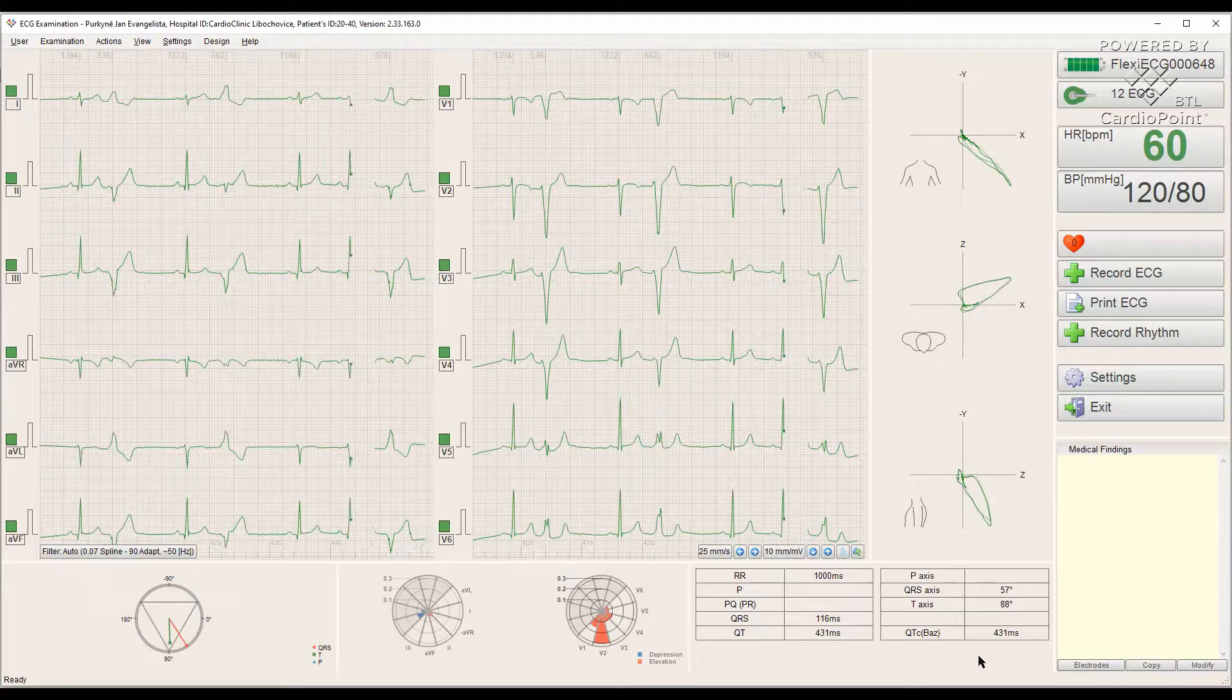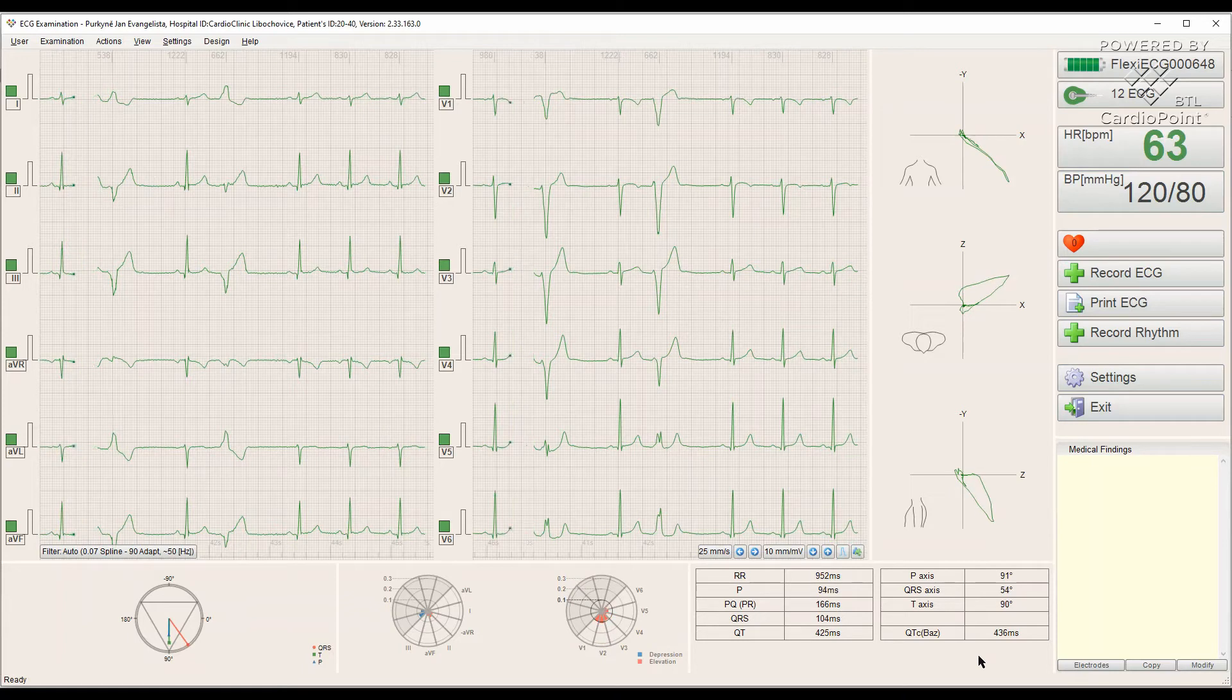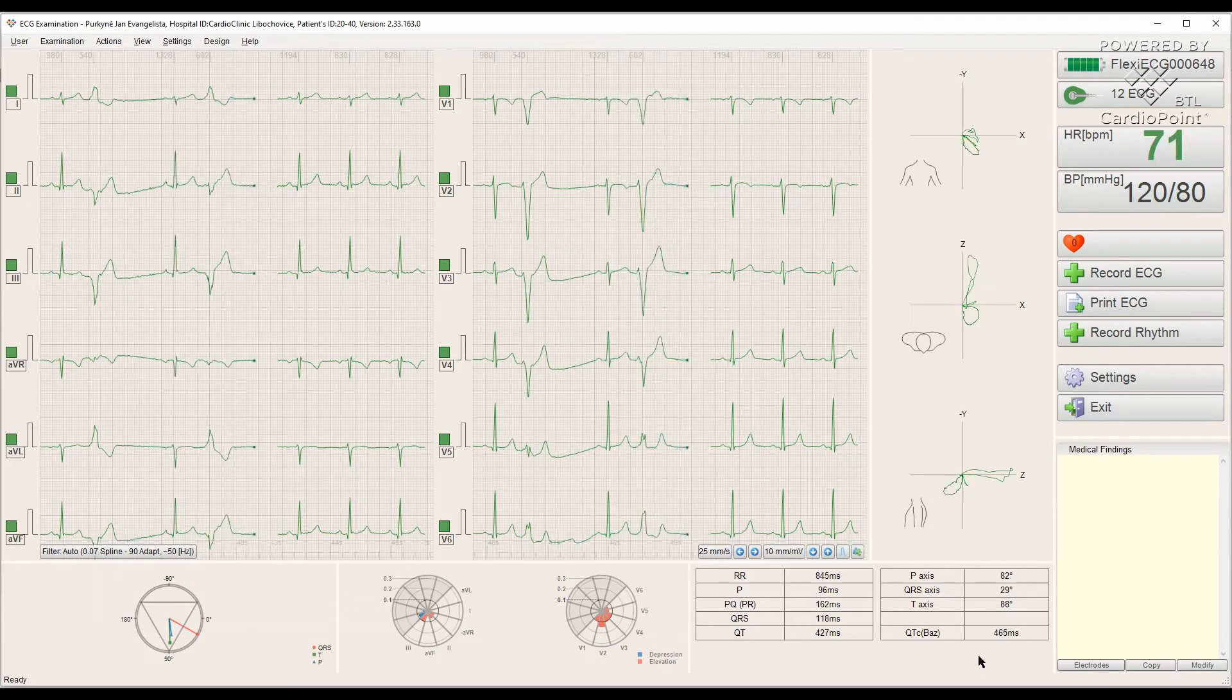In just a second, we can see the recording screen with a 12 leads real-time ECG signal streaming.